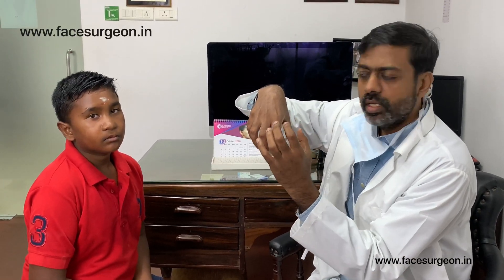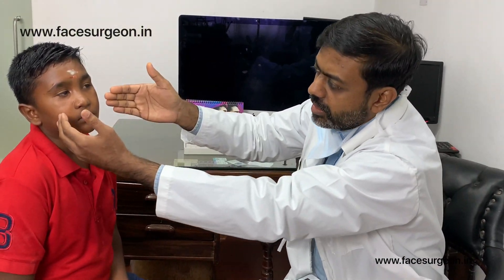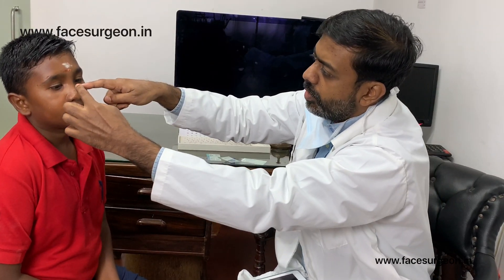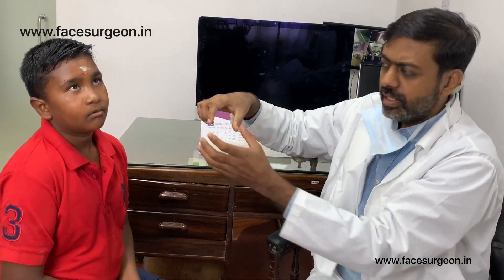He has no pain right now. The beauty of this procedure is that the distractor you see inside the mouth will be removed after four weeks, by which time his own body will have deposited new bone in the upper jaw. What we've done is split the jaw into two — the front part is moved forward while the back part stays behind. It's like cutting a bread slice: the cut runs at the base of the nose and down between the teeth, and the front portion is stretched and brought forwards.